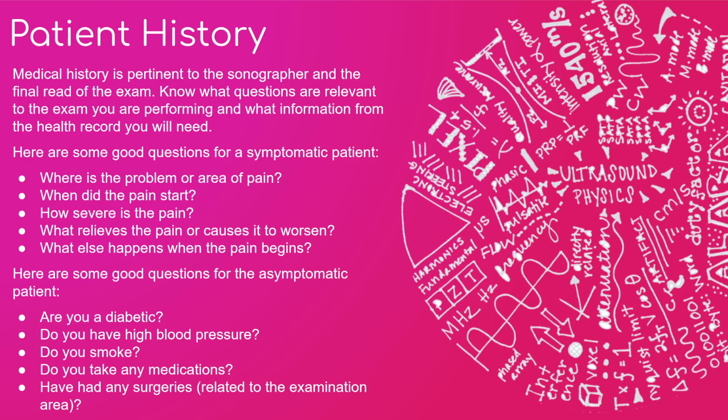Now, quite often you're going to have, again, access to that EMR, that electronic medical record. You'll be able to see what labs they've had, what medicines they're on, what previous imaging they've had. That's all stuff that you should be looking up as a sonographer. But quite often you'll get orders for a patient that you've never seen before, they've never been in your system, maybe they moved from out of state, you just don't have that background information. So you want to make sure that you're asking appropriate questions for your patient in relation to your exam.